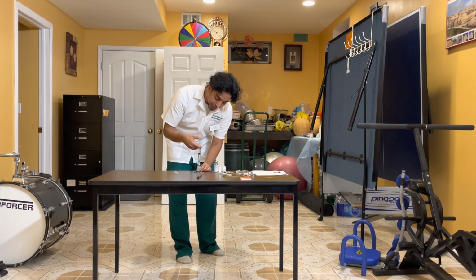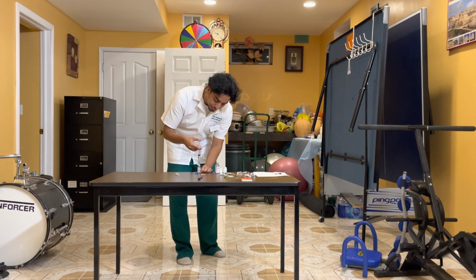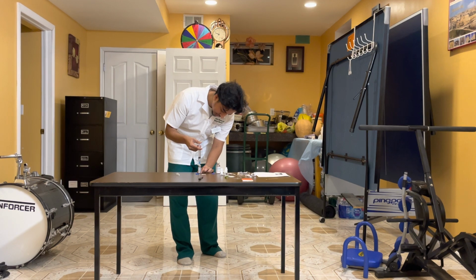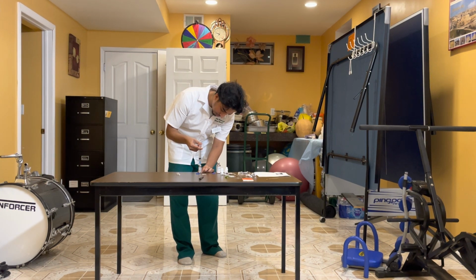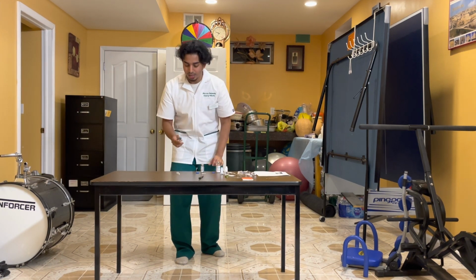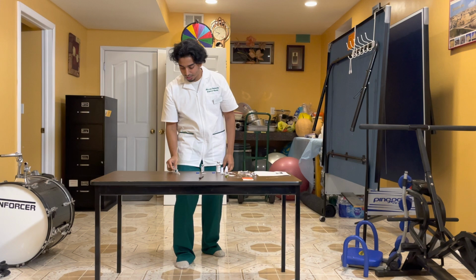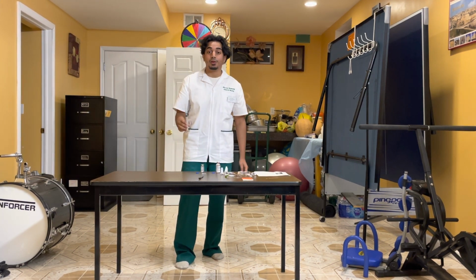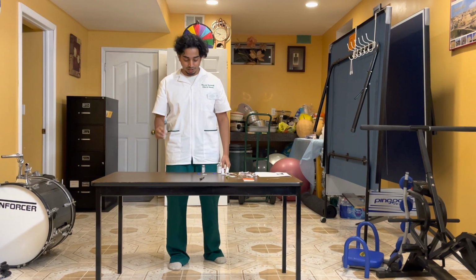I'll be doing it at a rate of 1 milliliter per second. Okay, once I've done that, I recap it. Once it's recapped, I put it in the sharps hazard container.